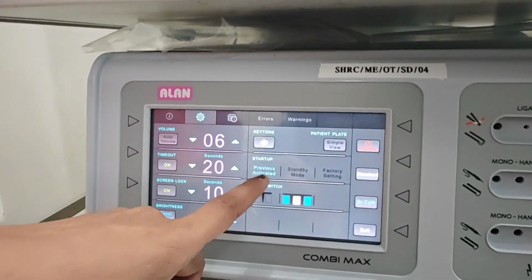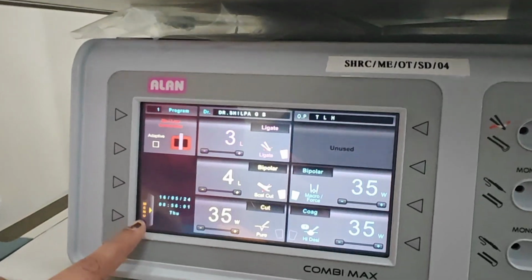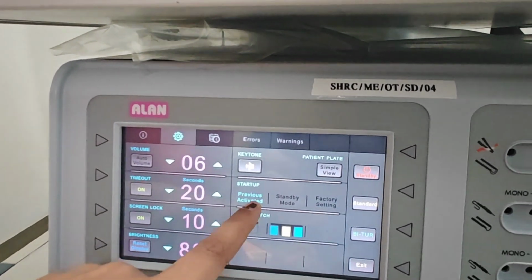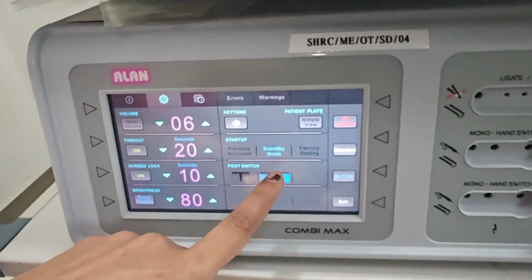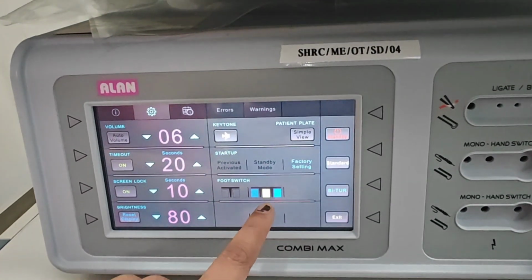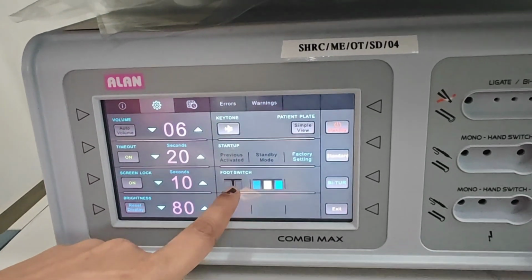The important ones are the previous activated settings, standby mode and factory settings. If I go to the previous activated mode, then whichever mode we have used in the previous surgery gets activated. And if it is in the standby mode, then it will not work. Then factory settings, again depending on the factory settings that it comes with.